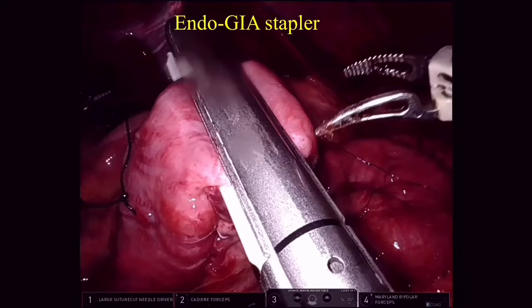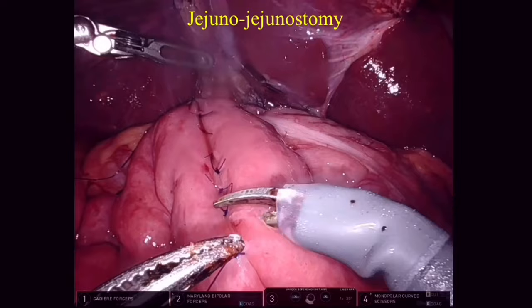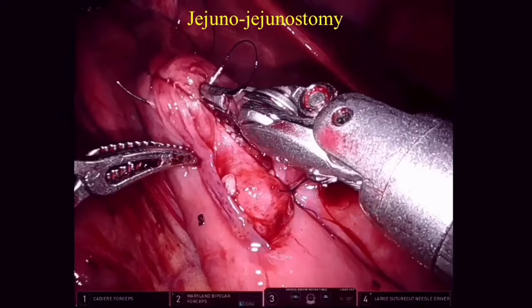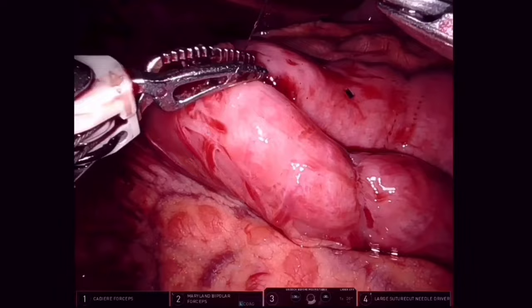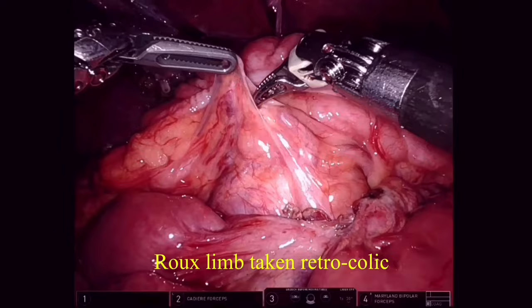The site for jejunojejunostomy is chosen and marking sutures are placed. As this is a bigger child, we are doing an intracorporeal jejunojejunostomy with the help of an endo-GIA stapler. The stapler is fired and the opening is then sutured with polydioxanone in a running fashion. A few seromuscular sutures are placed to cover the staple line, completing the jejunojejunostomy.